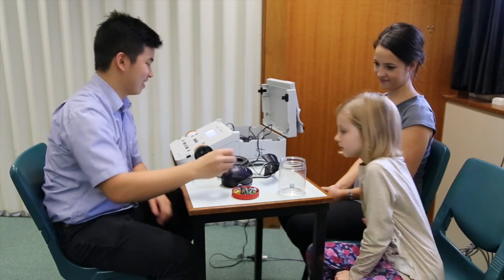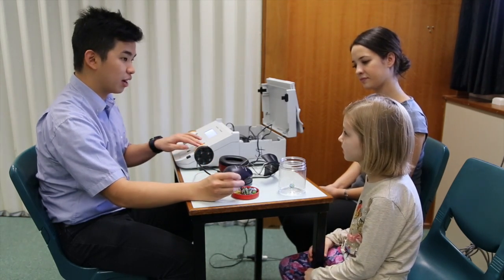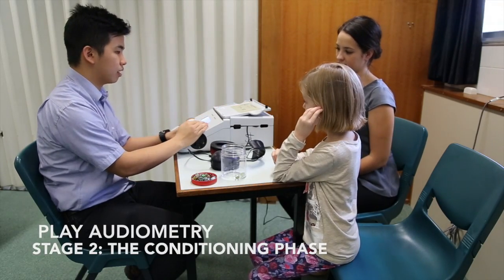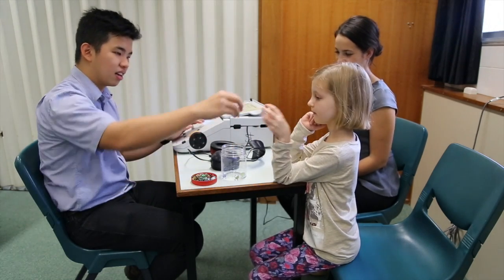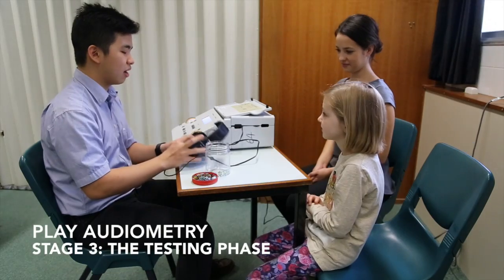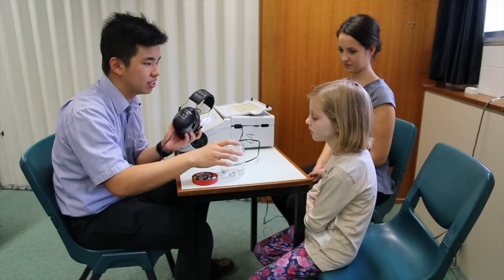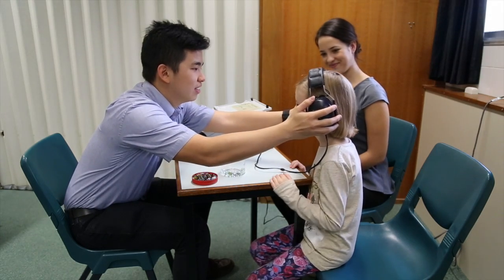The clinician needs to condition the child to respond to sound by placing a peg in a board or placing a marble into a container. When demonstrating how the child should respond, ensure your stimulus is sufficiently loud enough so that the child understands the procedure. Make sure the child can carry out the response independently prior to starting the testing phase. It is important to praise the child throughout testing and to vary the play response before the child loses interest. For the testing phase, turn down the intensity of the stimulus. Instruct the child that you are going to put the headphones on their head, but they will hear the sounds just the same and that they still need to put the marble in the container once they hear the sound.